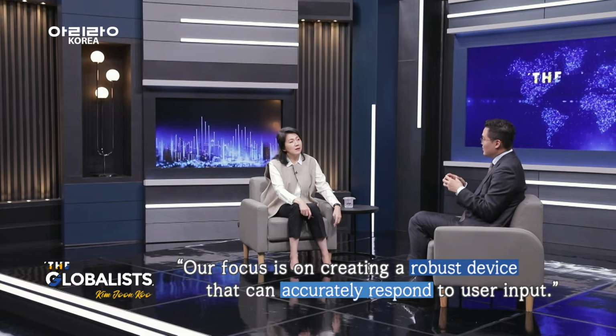Customizing it per surgeon, frankly, is not possible. However, this is a general purpose robot. So earlier we talked about it's for the combination of 4 motions. How to combine them, that's the surgeon's skills. So for example, if you're a urologist doing a prostatectomy, I'm doing it, you're doing it. Same robot, but the way of doing it is totally different, because how you do it is different from how I do it. Exactly. So that is why we focus on making a robot as robust as possible. So it's sort of refining the way each surgeon does a surgery, not doing it for him or her.